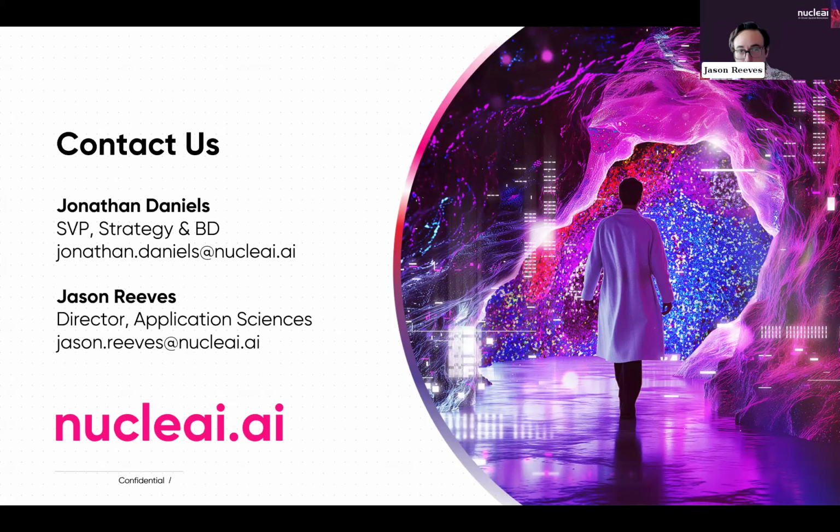We have worked with both of these types of data in the past to some extent, but they're not our bread and butter, mostly because a lot of the statistics that we are finding are really critical in the field right now are antigen driven, right? If you want to understand target turnover within a cell, you really need protein expression for that. And if you are analyzing data that is from RNA, you need to validate that the RNA quantification actually matches the protein expression down the road anyway.